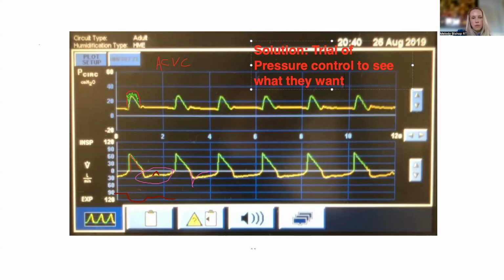I feel like there's probably a number for everyone where even in someone who you would allow a larger volume, let's say a patient with COPD, you would allow a larger volume, but how big? Like a liter is probably too much. You know what I'm saying? So I guess what I'm trying to say is that yes, I would switch him to a pressure-based mode, see what kind of volume he or she wants, and then see if that fits into our goals.